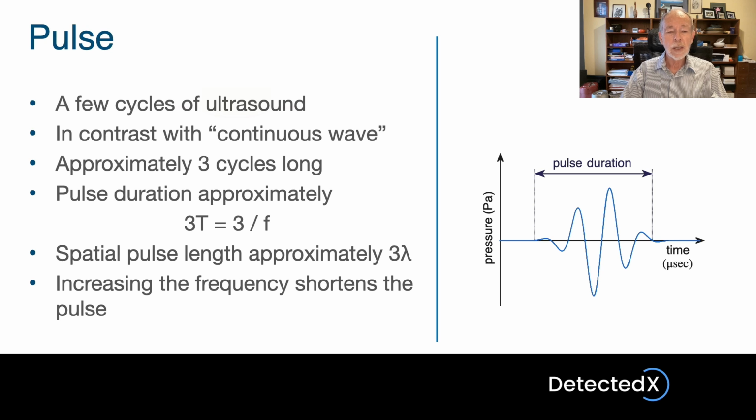A pulse is defined in contrast with what we call continuous wave ultrasound, which is where the ultrasound goes on indefinitely. This is used in diagnostic ultrasound as well, but only in continuous wave Doppler. All other diagnostic modes of ultrasound use pulses.